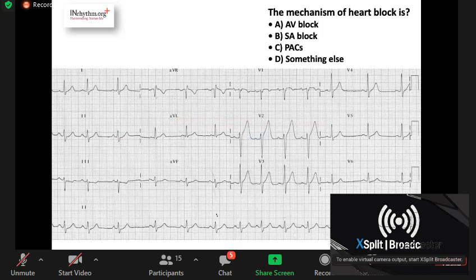Now look at this ECG. Sometimes you might say it is a normal ECG, but whenever you have ECGs like this, you have to devote some time. What do you think here? In each and every ECG, whether normal or abnormal, always try to calculate the intervals. More particularly, when you see a cluster of QRS complexes in a particular zone of the ECG, it is better to caliper so that you can make a sensible analysis. So let us do that.